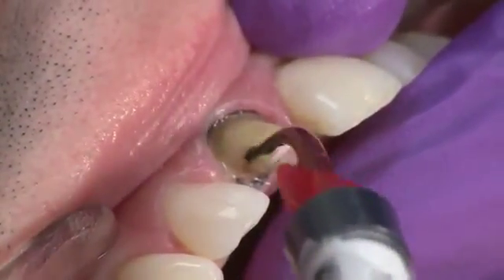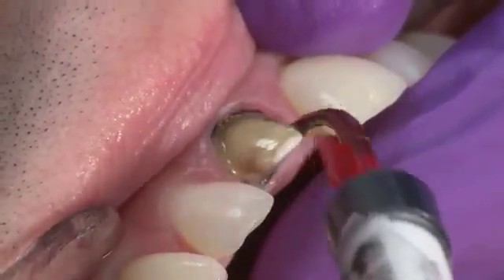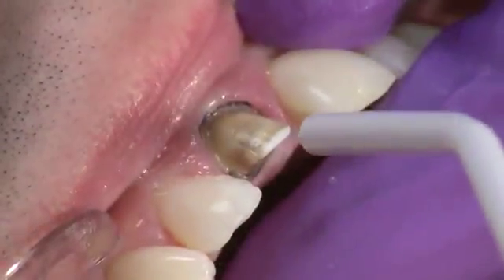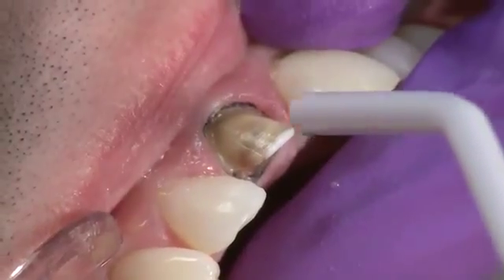Next, apply a puddle coat of PEAK Universal Bond and gently agitate it into the preparation for 10 seconds. Thin and air dry for 10 seconds using full air pressure.